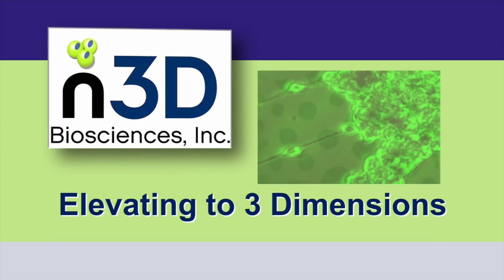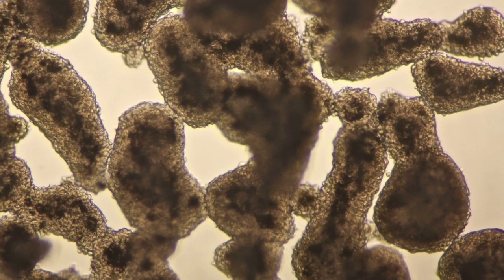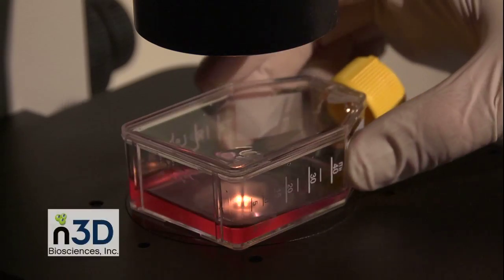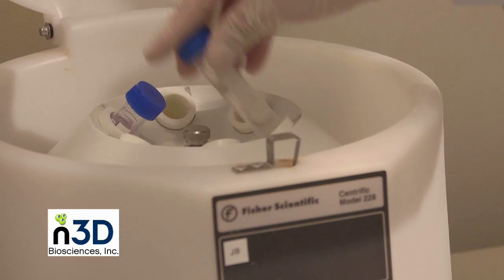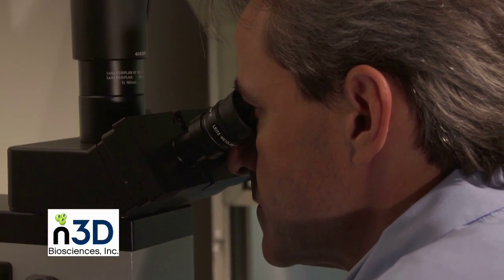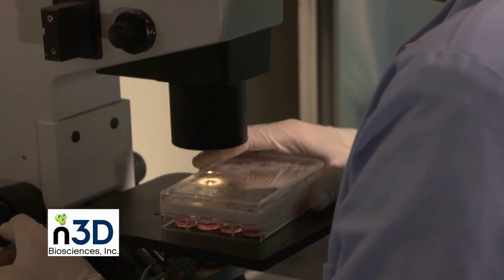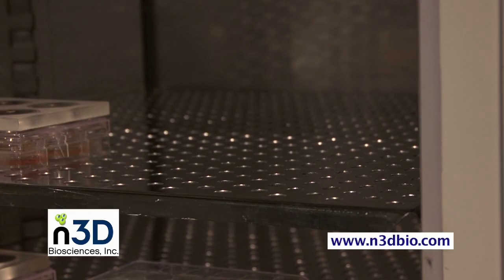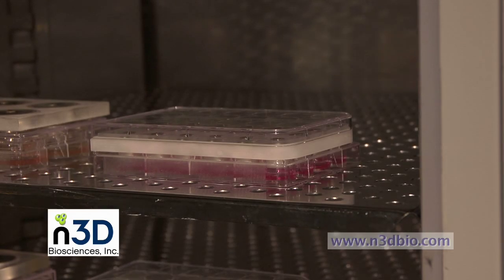Nano 3D — Elevating to Three Dimensions. Laboratories engaged in basic life science research, drug discovery, and tissue engineering use the BioAssembler from Nano 3D Biosciences to culture cells in three dimensions. This user-friendly technology yields cultures that more closely resemble in vivo tissue in both form and function. It's as easy as conventional 2D methods and requires a fraction of the setup and tissue assembly time than any other 3D method.